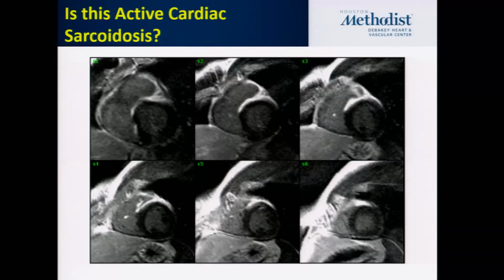So this is a patient that I saw many years ago during my fellowship, and the patient came in with VT and syncope. 35-year-old, healthy otherwise, no prior disease. He was working on the field and just passed out, and the first rhythm that EMS saw was VT. When the patient was resuscitated and we ruled out coronary disease by angiography, we got an MRI, and you can see here the extensive late gadolinium enhancement that we see in this patient.